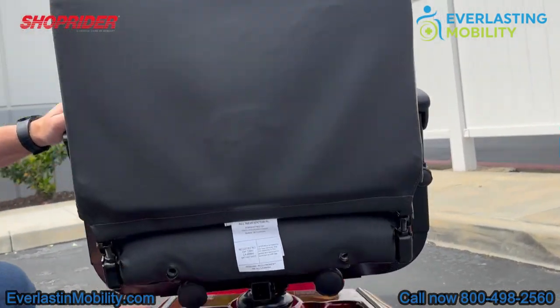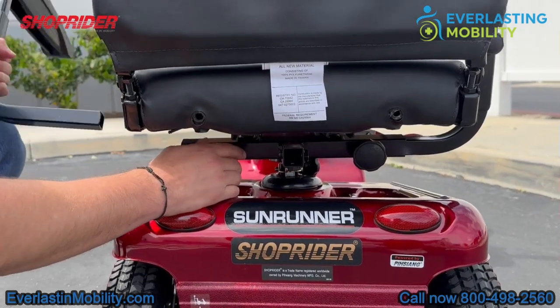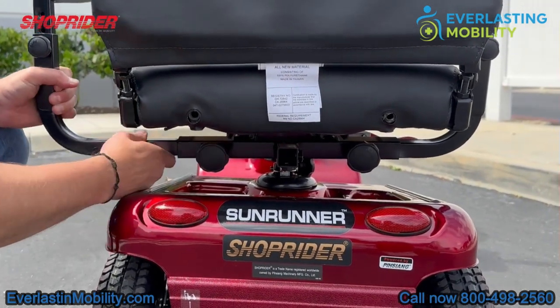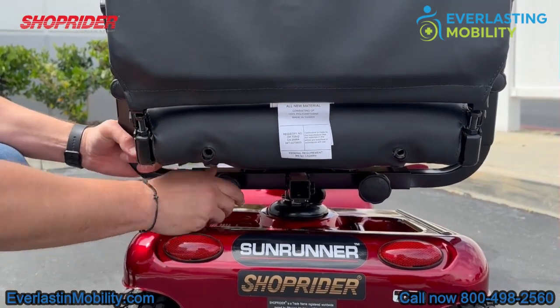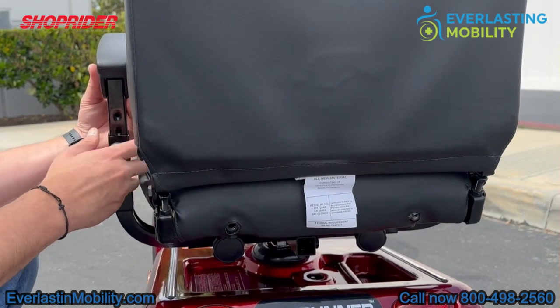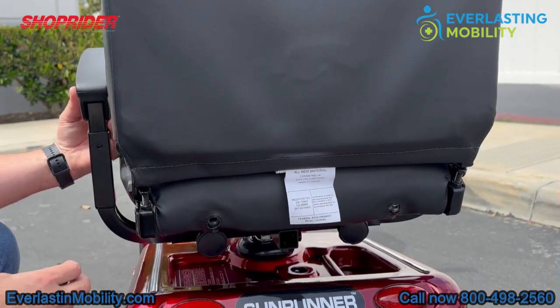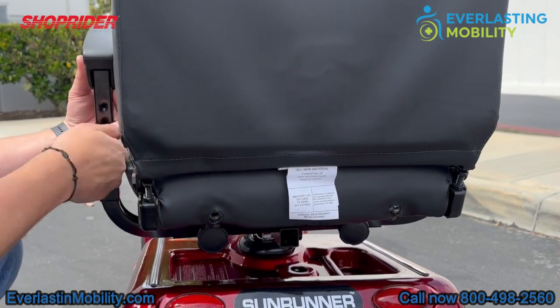Another great feature is that the armrests are width-adjustable. There are two little knobs — if you loosen them, you can increase the width of the armrests. On top of that, the armrests have two additional knobs that adjust the height of the armrests as well. So the armrests are both width-adjustable and height-adjustable.